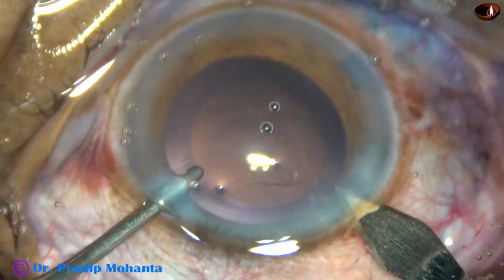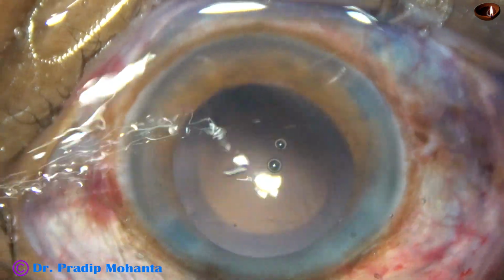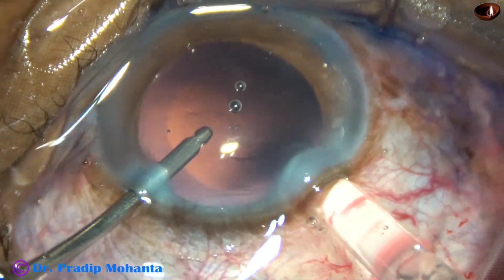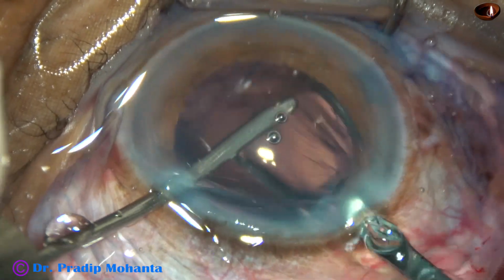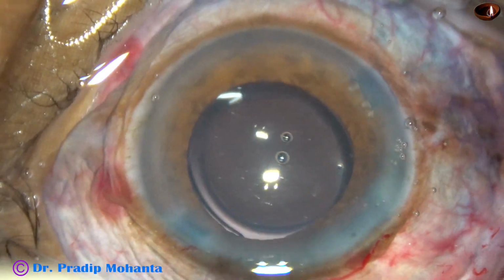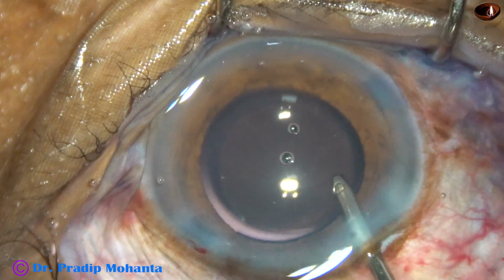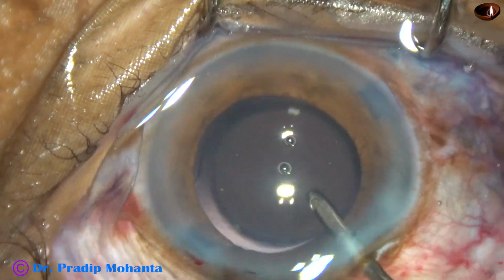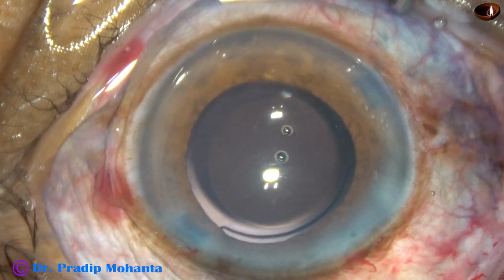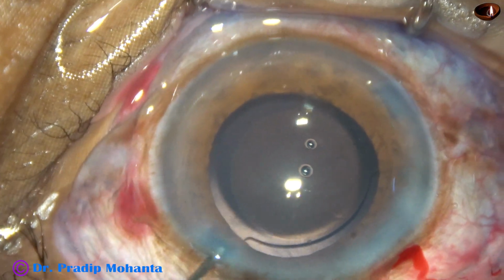Posterior capsule is clean. The incision is enlarged a little bit because I am going to use a B cartridge. And now this is hydroimplantation. Hydroimplantation means the anterior chamber is filled up by the irrigating probe and the intraocular lens is implanted under irrigation without using any viscoelastic substance. The lens is nicely in the capsular bag and the optic is all around. The optic is covered by the anterior capsular rim. So the size of this rhexis is about 4.75 to 5 millimeter.